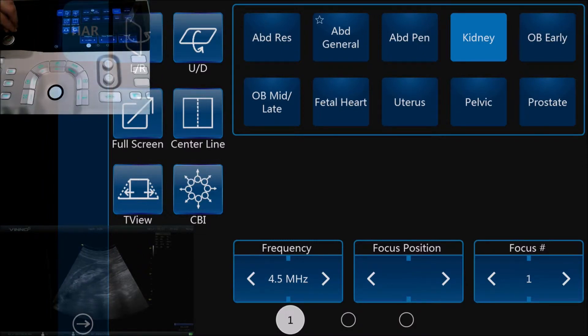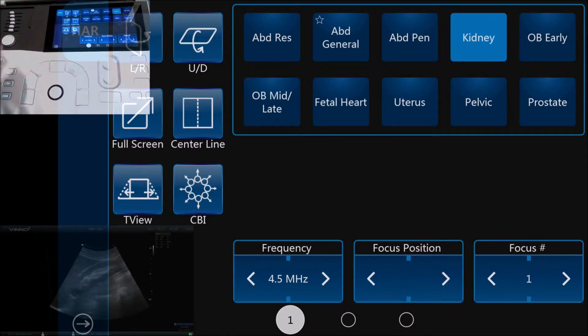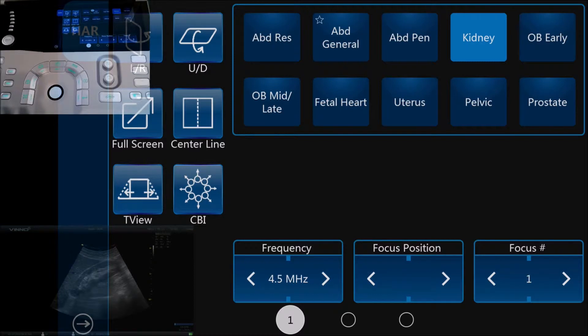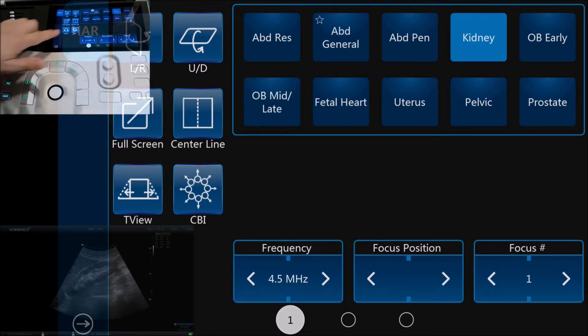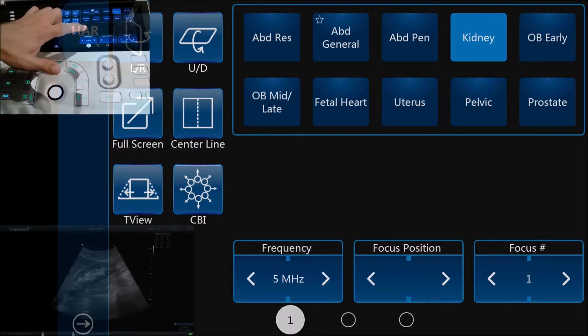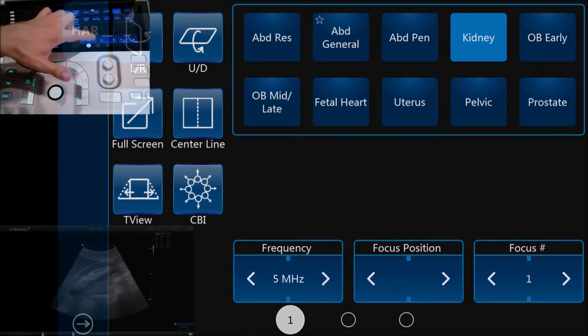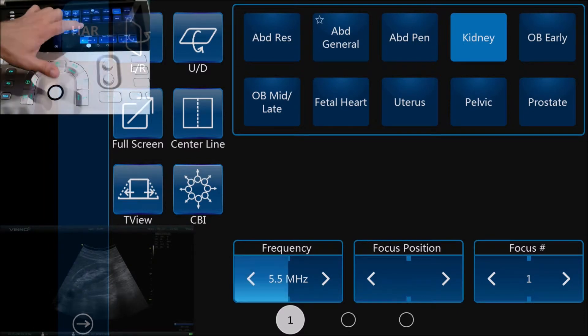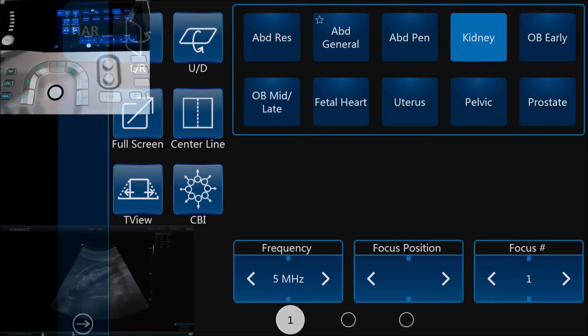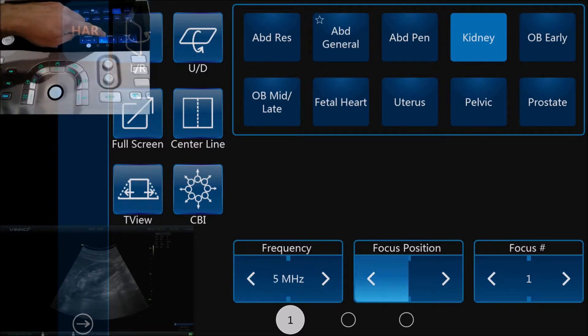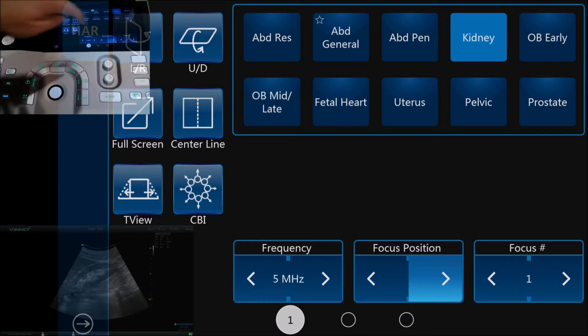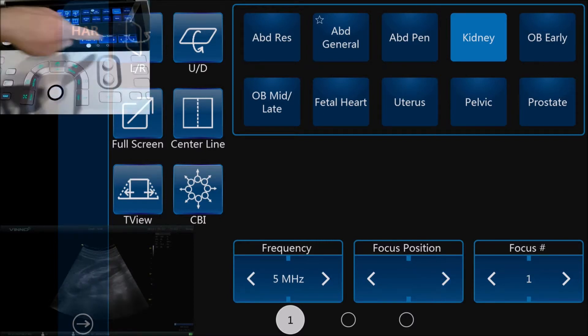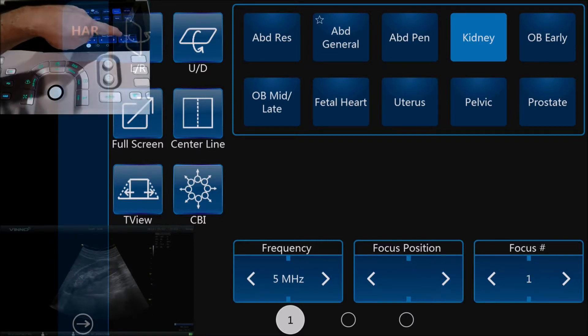Moving along, we look at the touchscreen. Here we can adjust the frequency if we need to to improve the clarity of the image, and we can move the focus position so it's in line with the area of interest. We can also change the number of focus arrows, so we can increase the width of the focal zone if we want to as well.